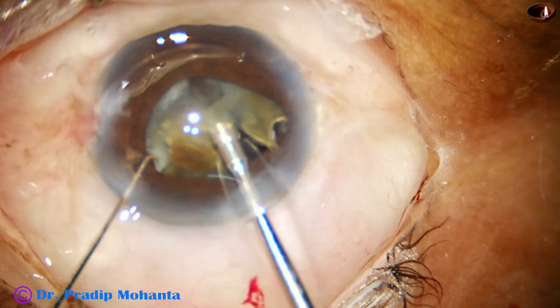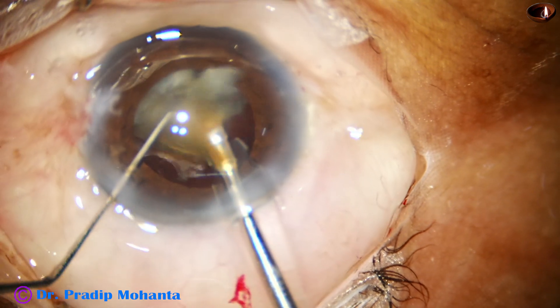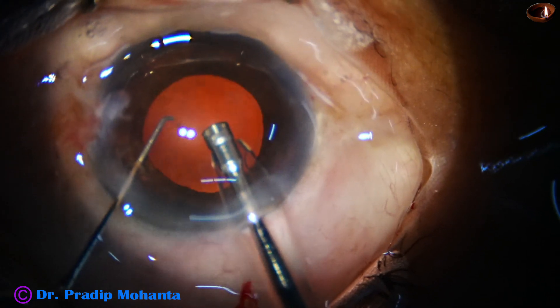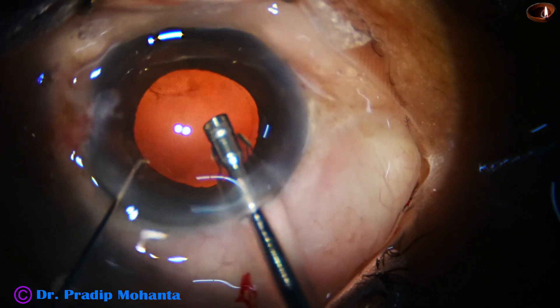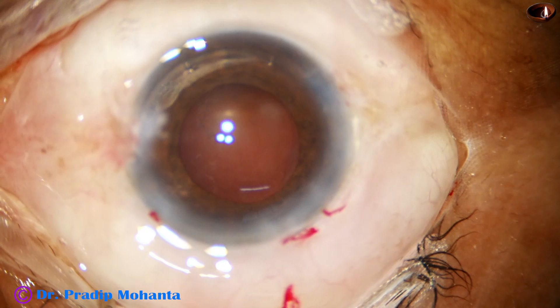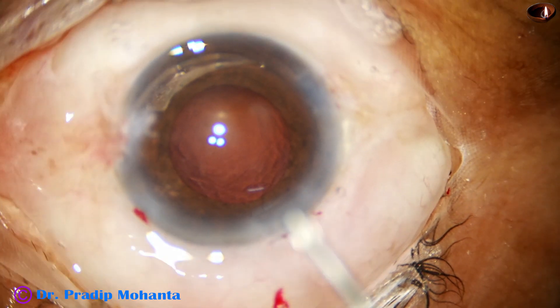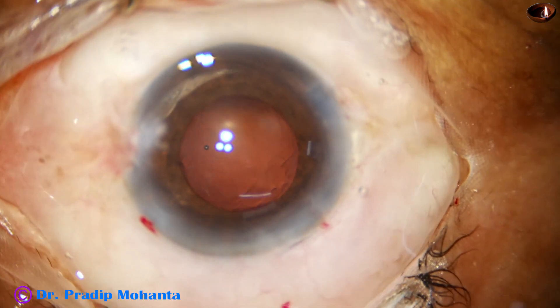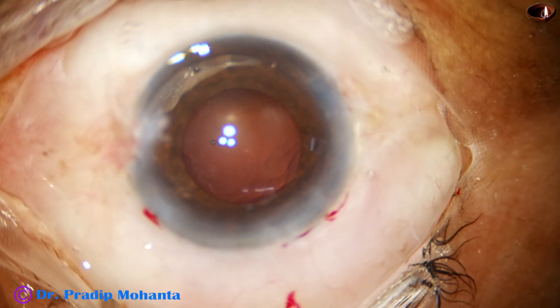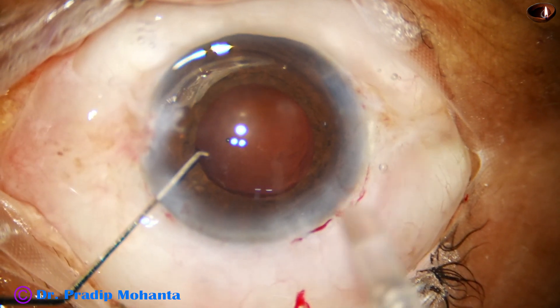Here I am trying to keep the epinuclear shell intact and emulsifying only the brown nuclear part. When this is done, I use the coaxial illumination where I get more depth perception. With coaxial illumination the depth perception increases, and we can see where we are clearly. It is good to use coaxial illumination during emulsification of the last piece, if the microscope has that option.